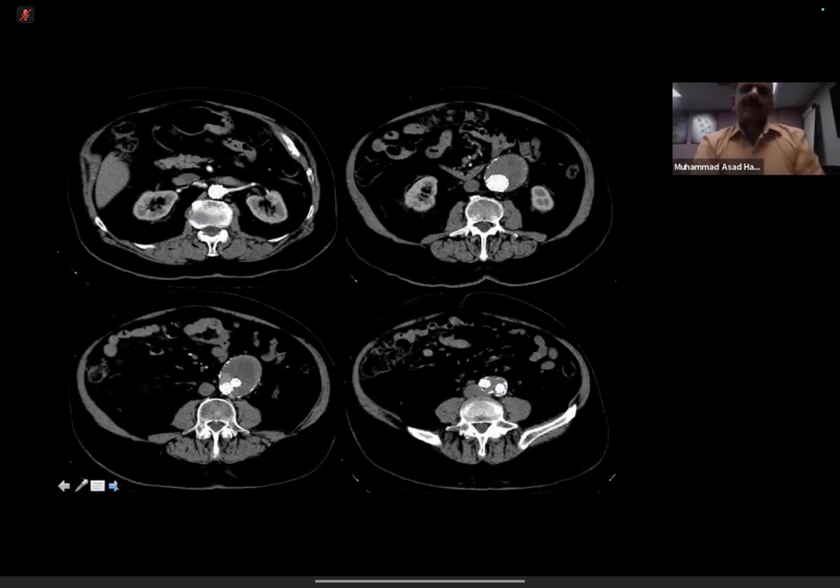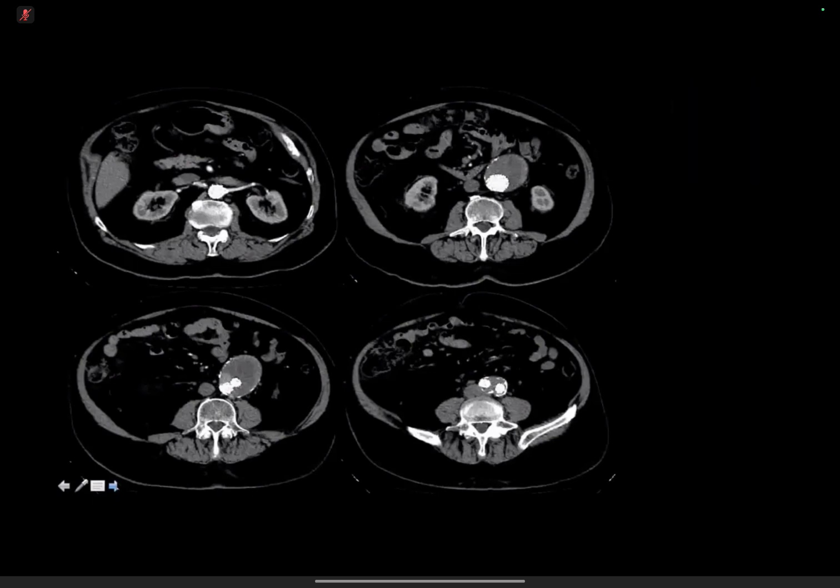There are quite a few telltale signs that this patient has had an aortic aneurysm repair. You can see the contrast is well defined, and very small metallic struts around the contrast. I'm afraid I could not window the endoleak appropriately to show it for the presentation. I'll see how I can improve it in future.